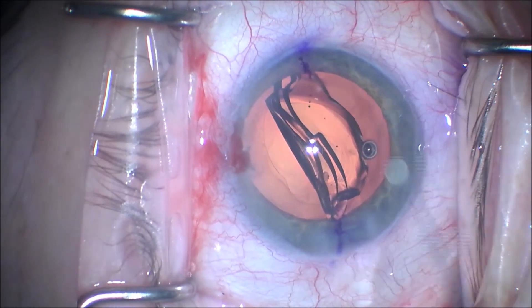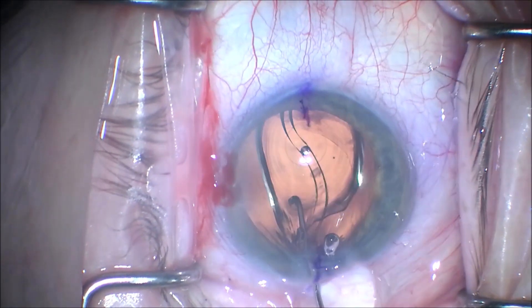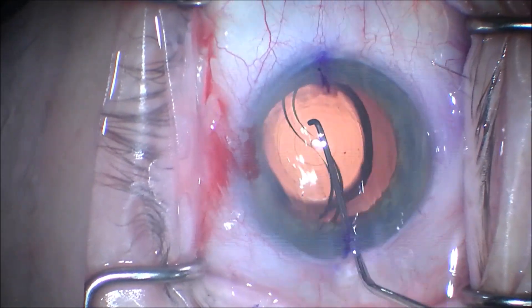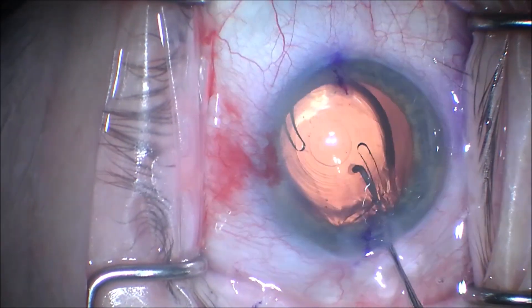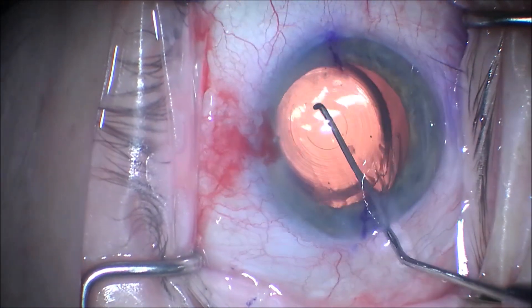Once the lens has been injected, sometimes the haptics will stick to each other, and they usually release on gentle manipulation. You can see the intraocular lens has been placed into the capsular bag. The haptics have just released, delivering them into the capsular bag.